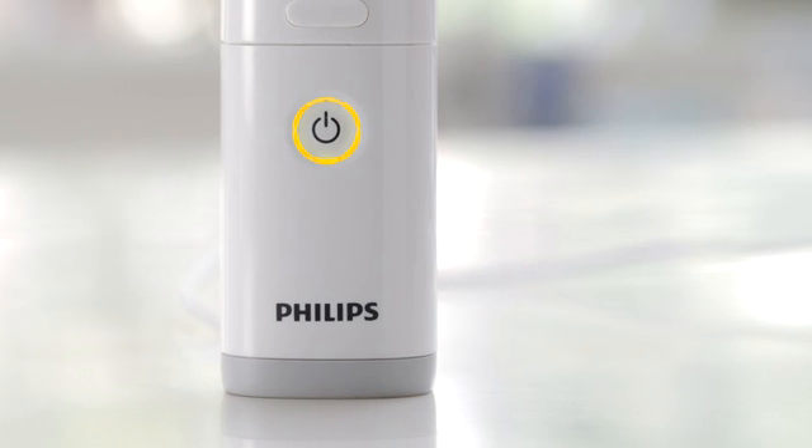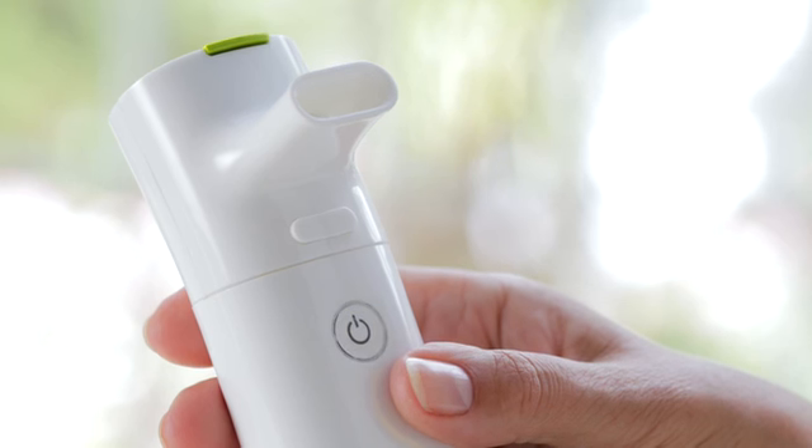If the light is amber, there's enough charge for at least one more treatment, but be sure to charge your nebuliser after your treatment. If the light flashes amber and then switches off, there's not enough charge to take a treatment. If this is the case, simply use the power adapter to continue.